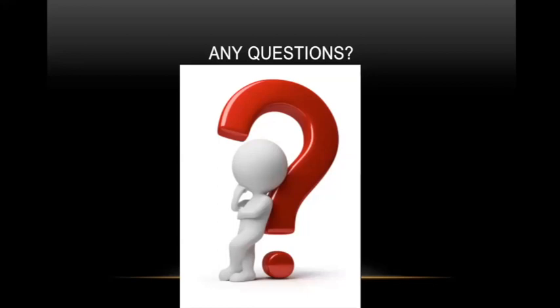So far there are none, and we don't have any questions from online either. In a nutshell, from experience, interpreting a spinal X-ray and CT can be very challenging. I agree, basic knowledge of the anatomy of the spine is very important before you interpret X-ray and CT. Dr. Erin has done a wonderful presentation today, in depth, about spinal X-ray and CT, and for that we thank you very much. If we have any further questions, we will either call you directly or email you, if that's okay. No problem.